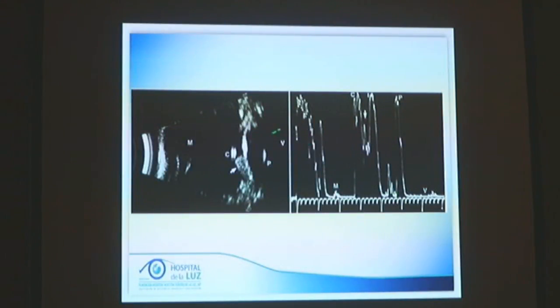Aquí estamos viendo una ecografía modo B estandarizada por inmersión. Si se dan cuenta, está el medio acuoso que usamos, aquí está la córnea, y aquí llegamos a encontrar lo que es la lesión. Prácticamente es una lesión de reflectividades altas o de alta brillantez, que en el modo estandarizado, aquí encontramos lo que es la córnea, la cámara anterior, y la reflectividad que se ve aquí es una reflectividad media alta.